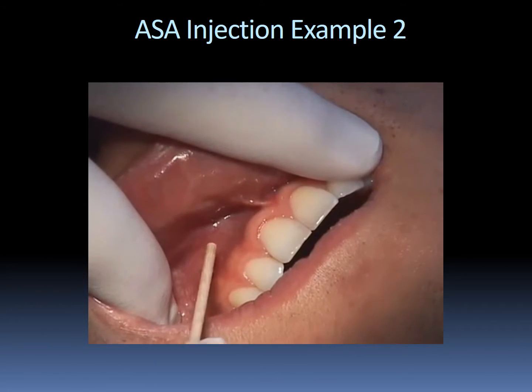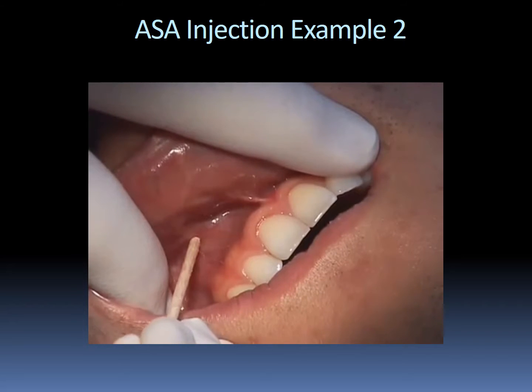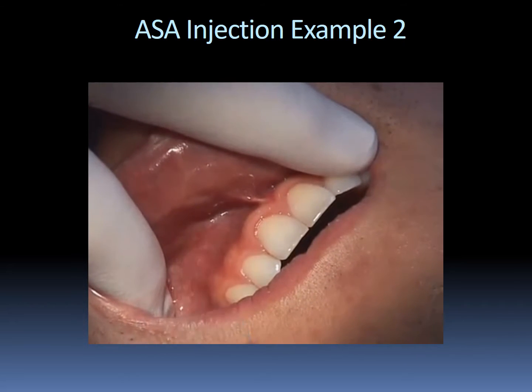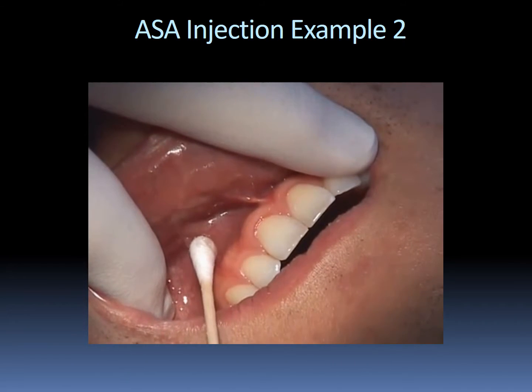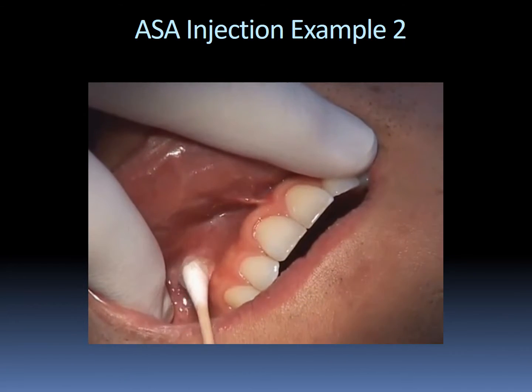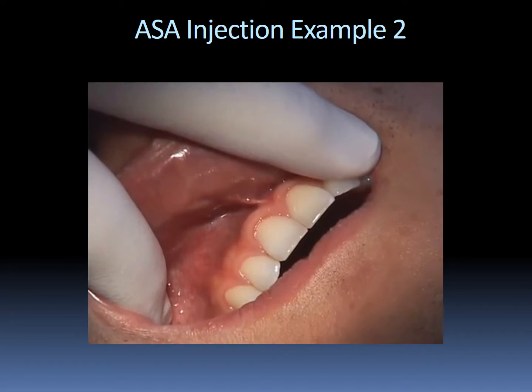Firmly retract the soft tissues. Establish the landmark by estimating the length of the tooth root and the position of the root apex. If available, a periapical radiograph may be used to confirm the length of the tooth root. Apply a small amount of topical anesthetic for 1 minute.